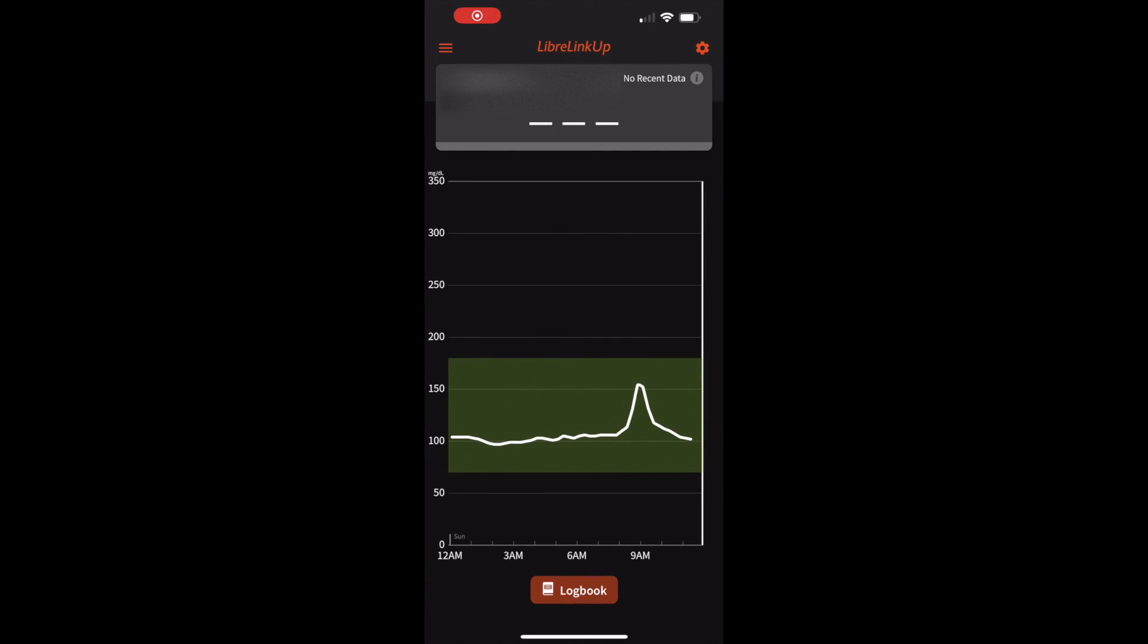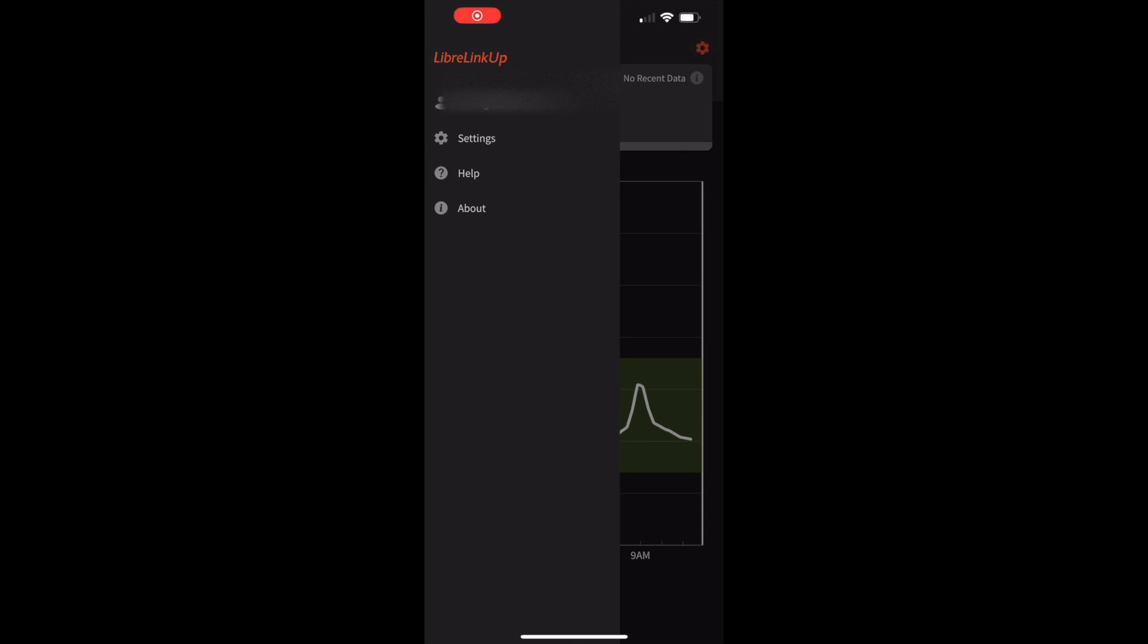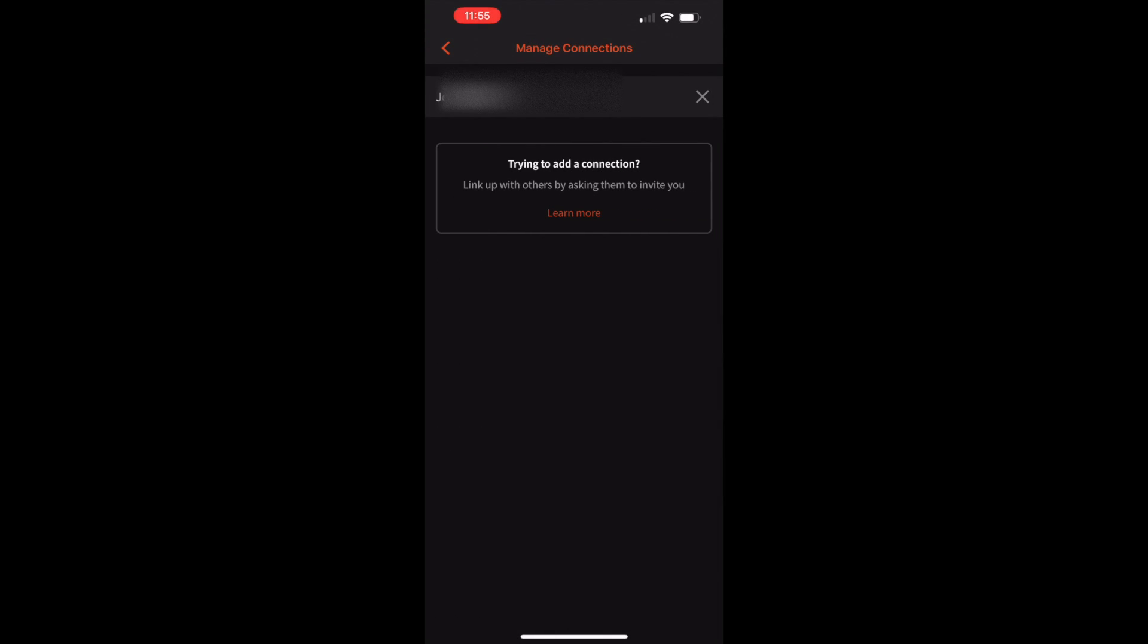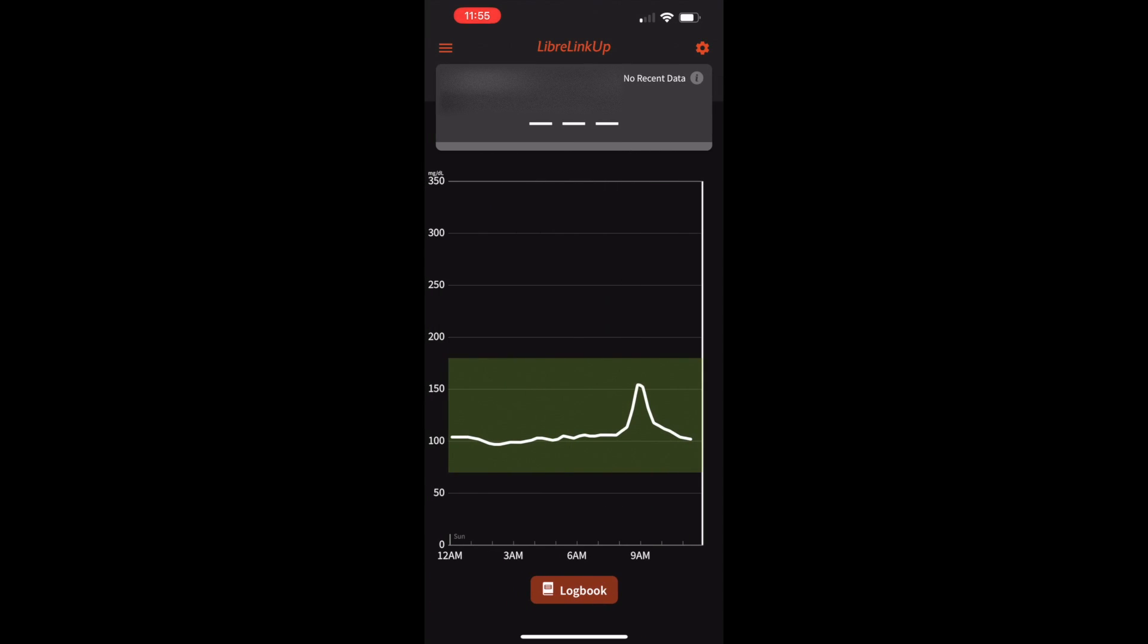So there's the Libre Linkup app with my profile visible.